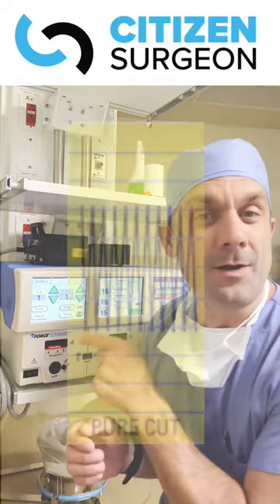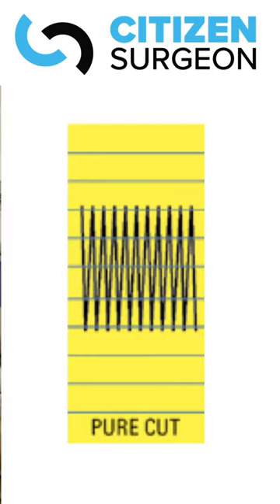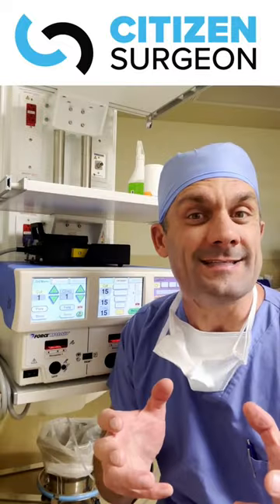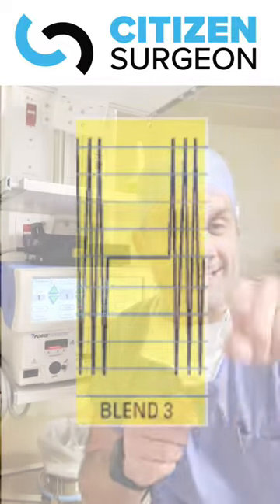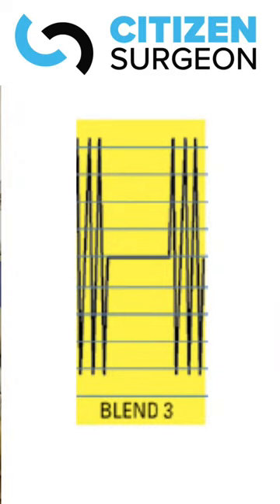When you use pure mode, the energy is continuous. If we want a little hemostasis, we use blend mode. That has the sine wave, but then it stops and you get a little cooling so you can have coagulation.